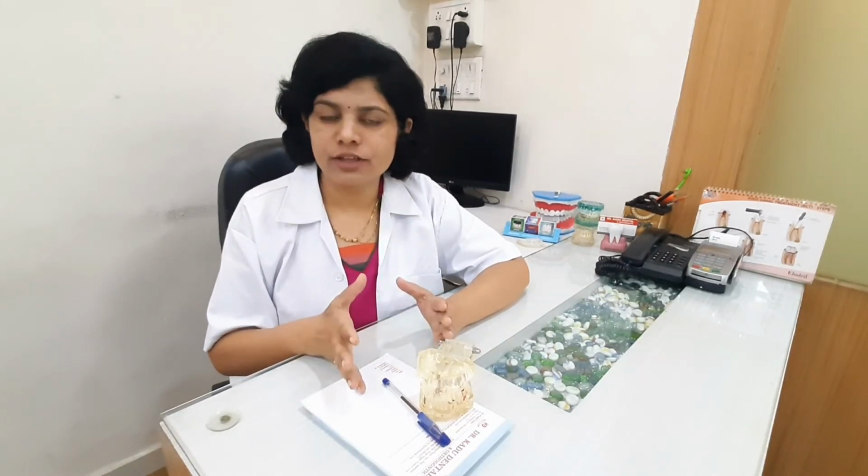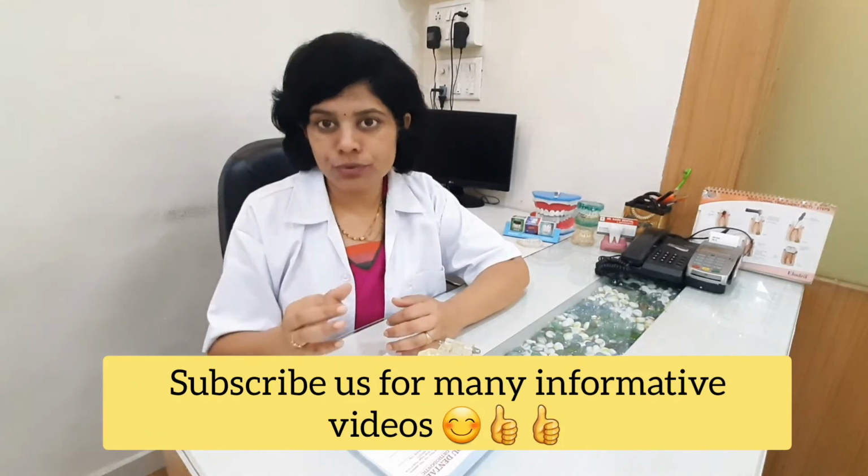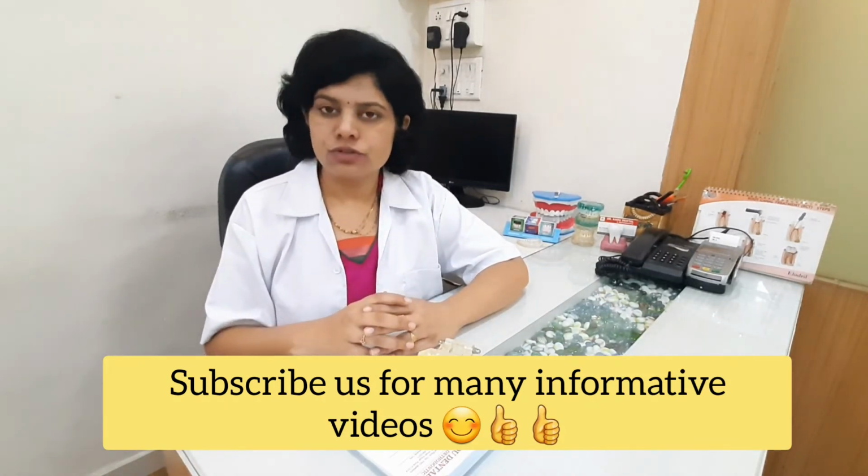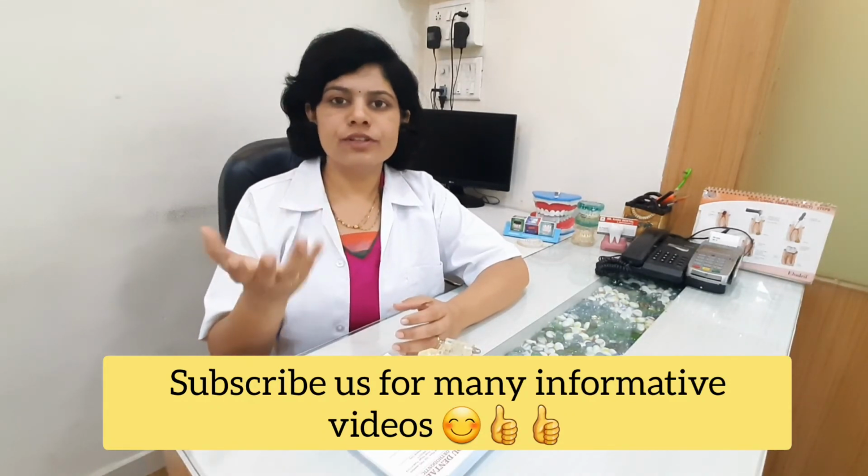In some cases, the patient may feel that the implant has become loose. In such cases, immediate attention of your dentist is required. Your dentist may check it. Most of the time, crowns which are fixed with a screw sometimes become loose and the patient feels that the implant has become loose. So in such cases, just fixing the screw will solve the problem.